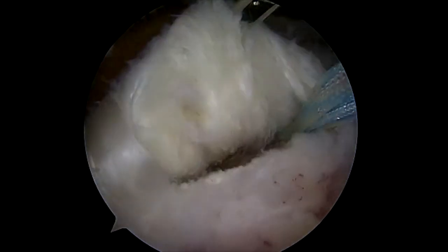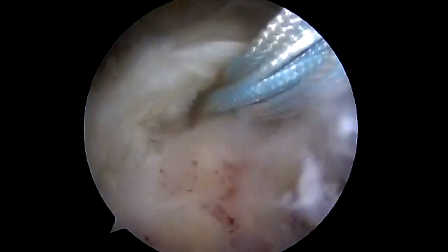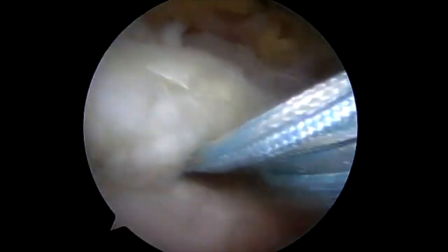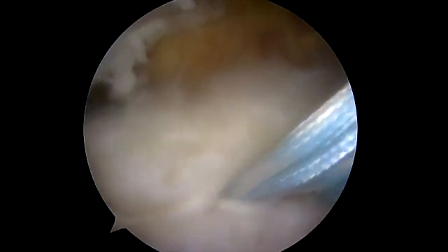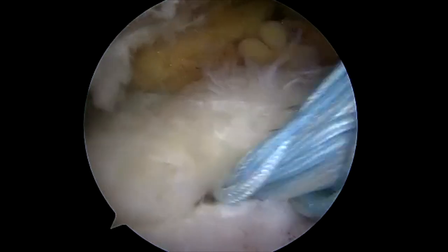The process is repeated anteriorly. Again, the suture shuttle is placed with the chia. Through it a passing suture is placed. The tape and sutures are loaded through the passing suture and then shuttled through the supraspinatus tendon.